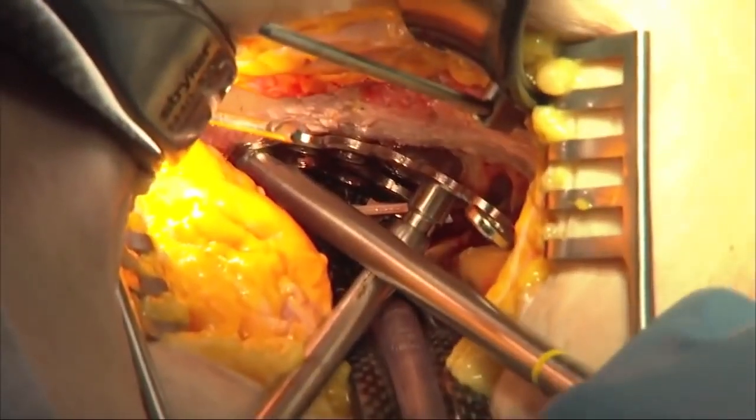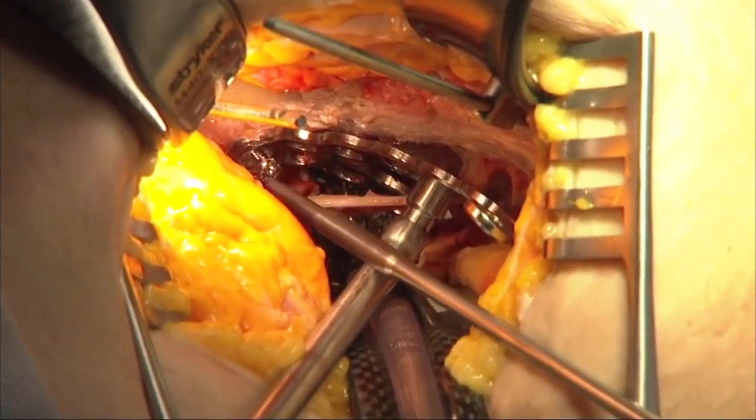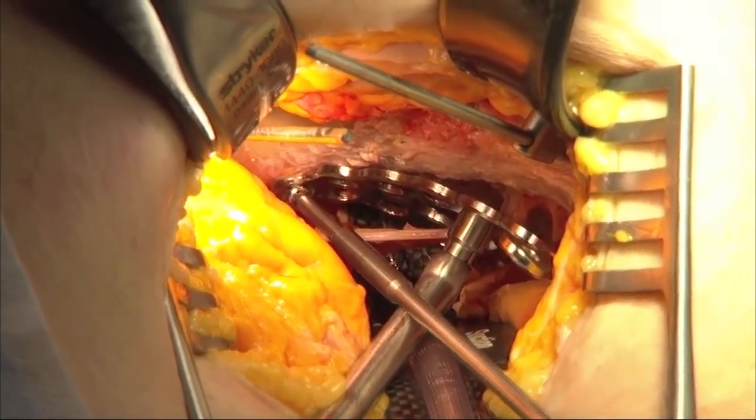Once the screw is almost completely deployed and you've stopped at the yellow mark, the screw advances the remainder of the way without the screw insertion handle in place, to avoid capturing the screw insertion handle inside the plate with the screw head.